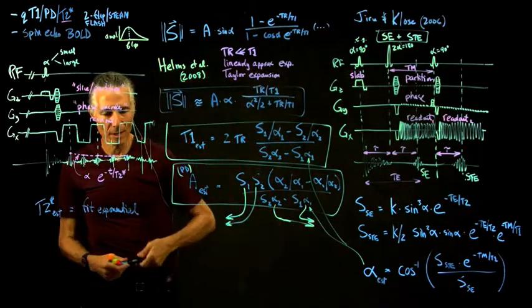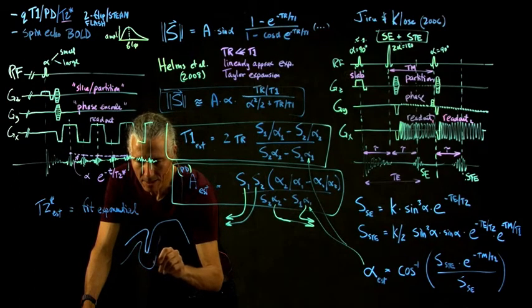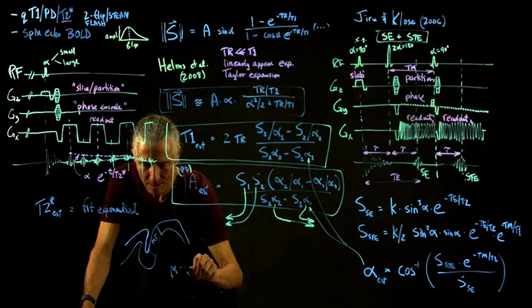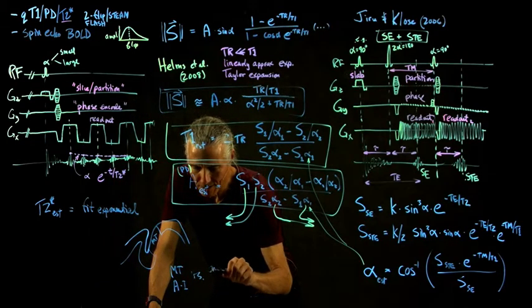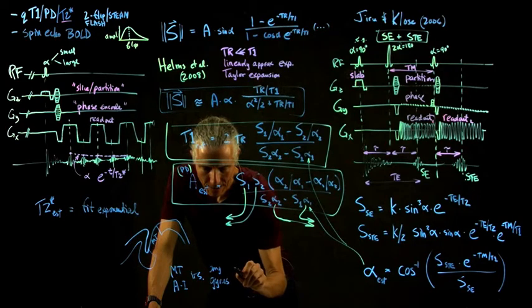through all this trouble? Well, the problem is if we're trying to look at, say, an area like MT, which is very highly myelinated, or area A1, which is very highly myelinated, the difference between that versus the angular gyrus, an example that's not very myelinated, is only like a 3% to 4% difference.